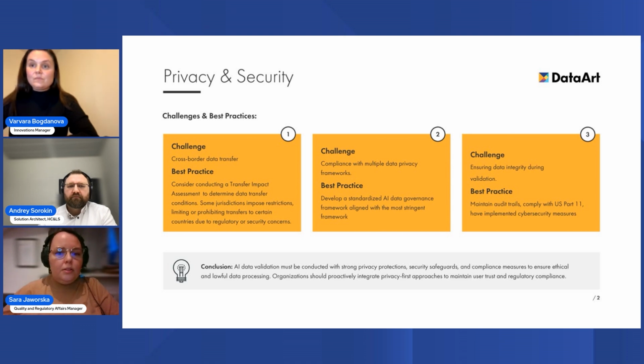And the third important thing here is that privacy and security must be built into AI development from the very beginning. So this means, for example, secure architecture, minimizing data collected, documenting legitimate interest for the use of those data, and limiting access rights. New standards will soon provide more clarity, but companies that adopt a privacy-first approach now will be better prepared for the upcoming years.